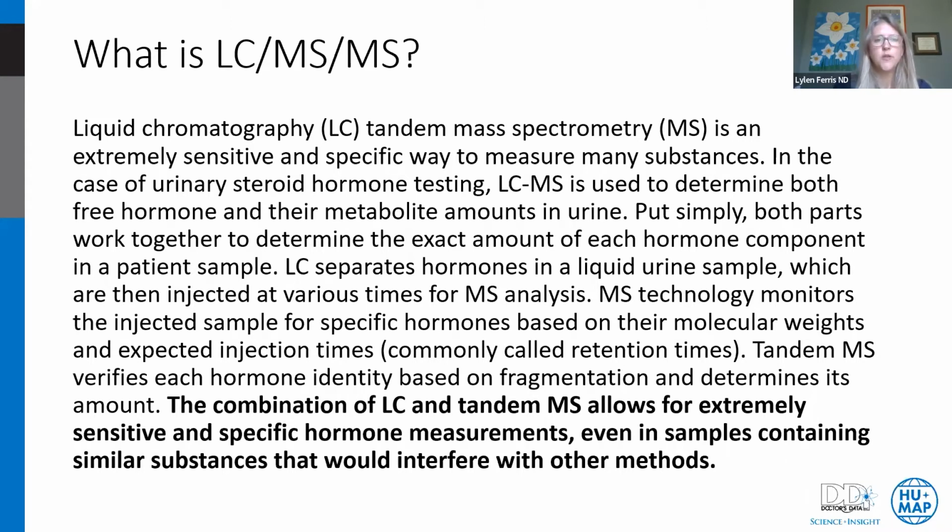The LC separates the hormones in a liquid urine sample, which are then injected at various times for MS analysis. MS technology monitors the injected sample for specific hormones based on their molecular weights and expected injection times, also known as retention times. Tandem MS verifies each hormone identity based on fragmentation and determines its amount.